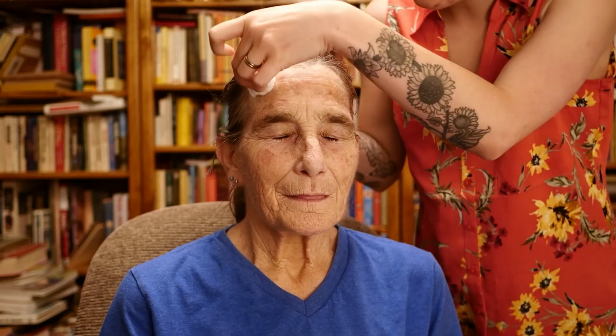So we are talking about our prep now, and what we're looking at is NuPrep. Remember that guy I mentioned? NuPrep, looking like this again, is very important for preparing any exposed skin area for the best EEG possible. So what we're going to do is prepare all of this forehead region, including the temples and the earlobe, with a little bit of NuPrep on a cotton ball. We don't need that much. A little goes a long way with this little green paste. And we're just going to dab in the regions that are exposed skin.